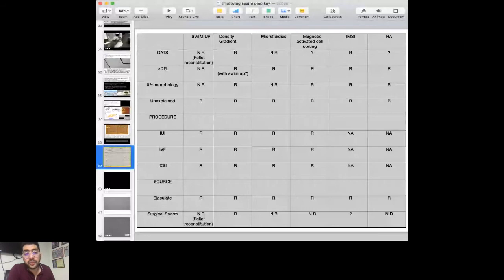And you want to follow it up with a preparation technique, so you will not get the best of the yields. So in such a scenario, generally the way to prepare the sample would be by density gradient, and then doing ICSI, or a higher sperm selection technique like IMSI can also be recommended for such patients. For PICSI, oligoasthenozoospermia is not recommended because you want a sperm count of at least 10 million in your sample in order to do PICSI for that patient. So that's what the general protocol and the general consensus is.